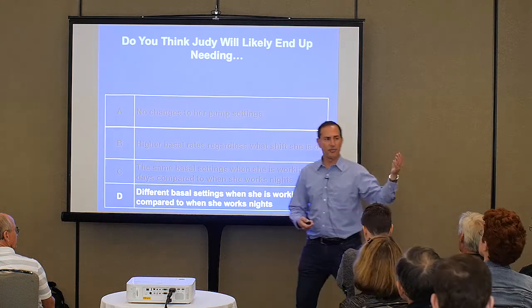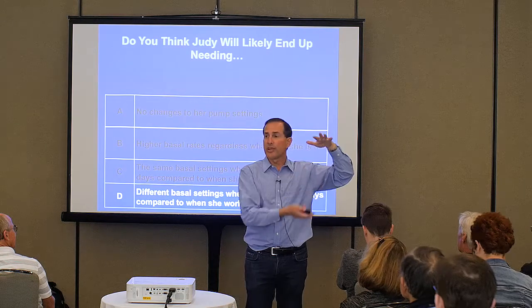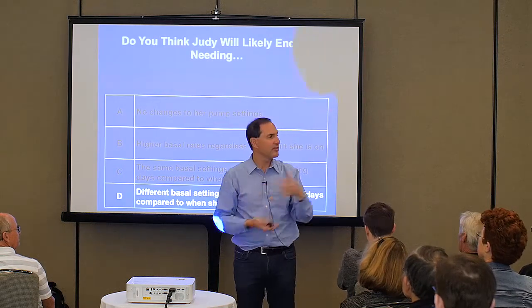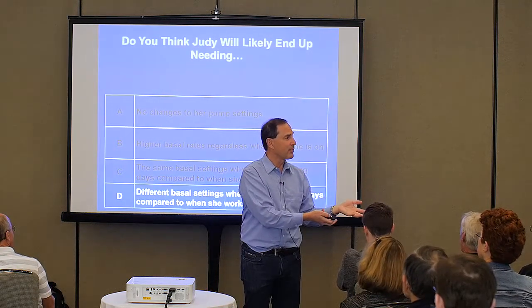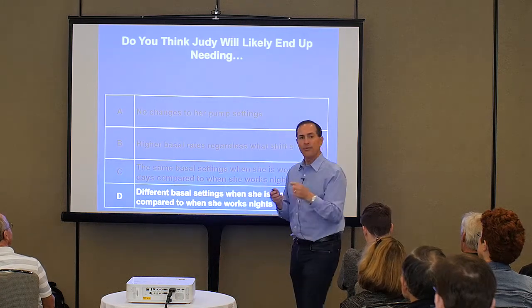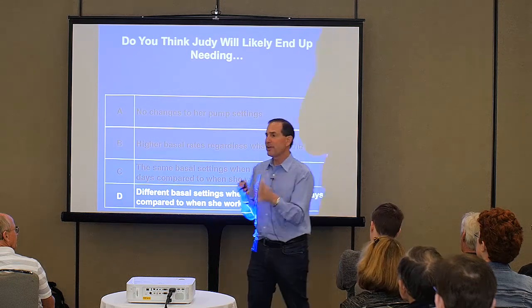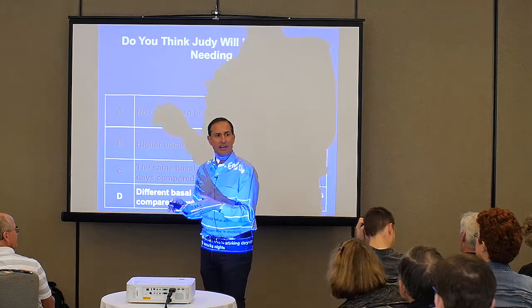Lovely. So just to reiterate, she has three different patterns. I'll just say two for the moment. Those days when she's working, those days when she's not, because your life is different on your work days. You probably get up at a different time. The level of activity is different. And I find very few people take advantage of this feature in their pumps. But most people, Monday to Friday, have a different life than Saturday and Sunday.